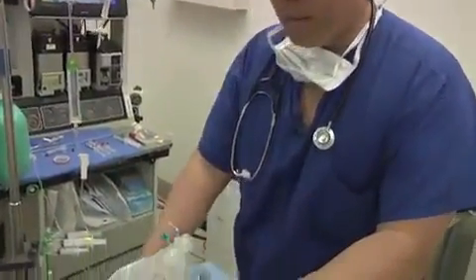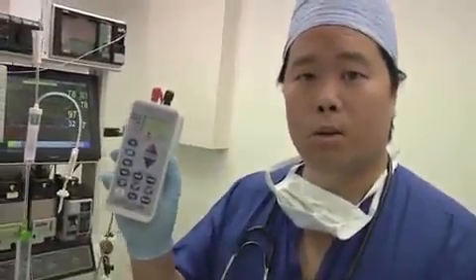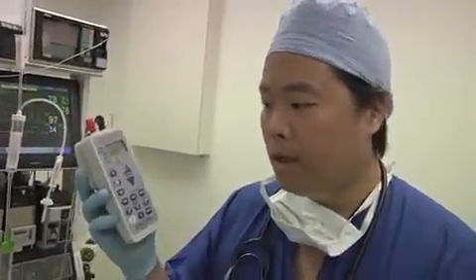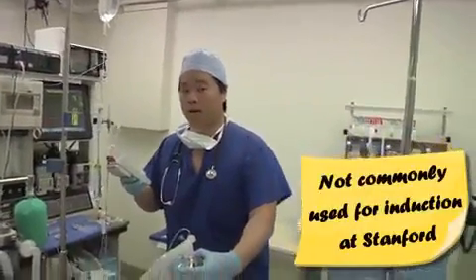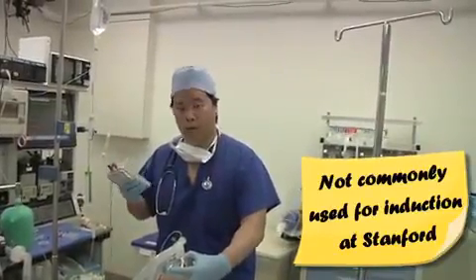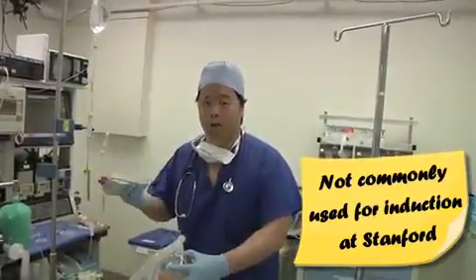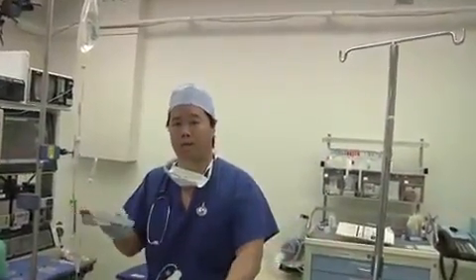One more thing that I'm going to mention here is that we have another type of monitor that you can use, which is a neuromuscular stimulator. And this will allow you to check for twitches. And it's not something that anesthesia attendings or residents typically use at Stanford on a regular basis. But for a first-year resident during your first month, I think it's a useful device so that you can learn to understand the pharmacokinetic and pharmacodynamic differences among different patients in the response to neuromuscular blocking agents.